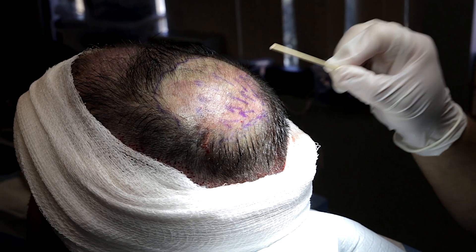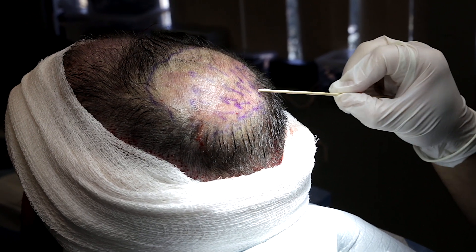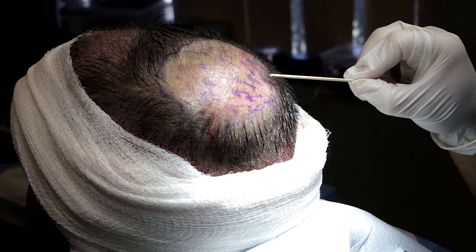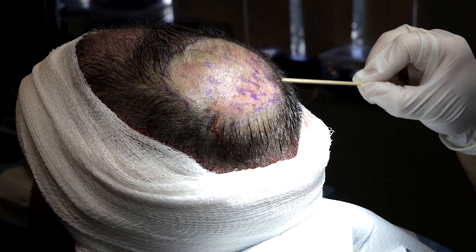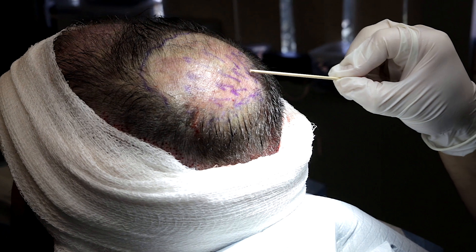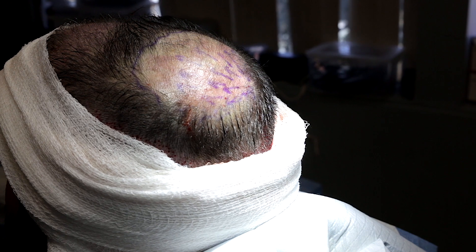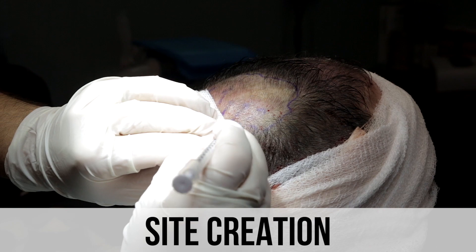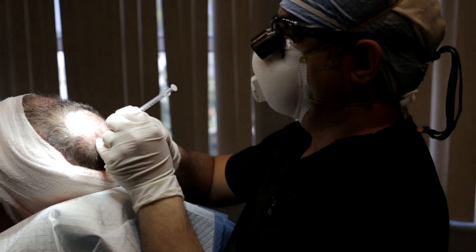This is the crown area right before I'm going to make the incision sites. The important thing to understand is that the cowlick is here and the hair is going in a spiral direction. To get the best results, we need to identify where the cowlick is, follow that direction, and make the hairs really flat to the scalp. I actually do not shave the hair so I can see the natural direction of the hair.